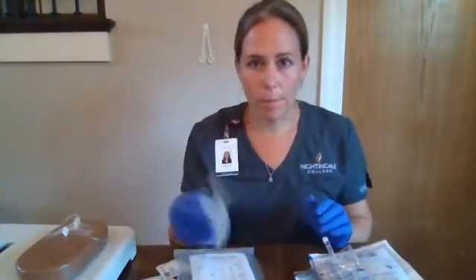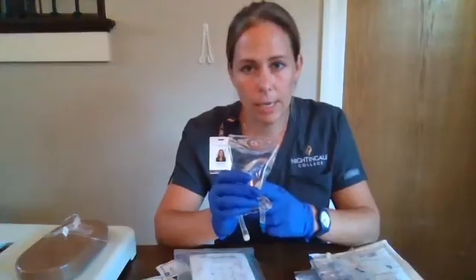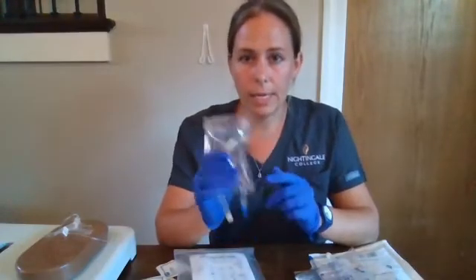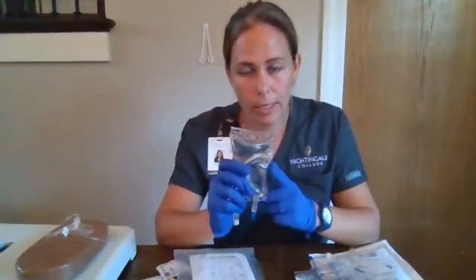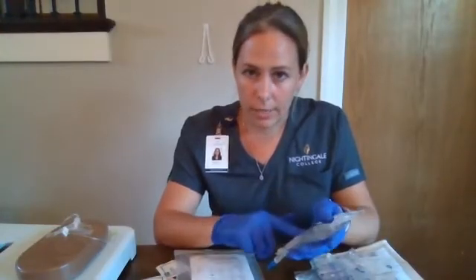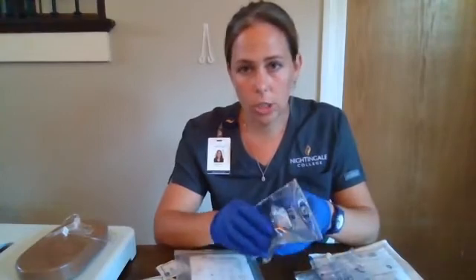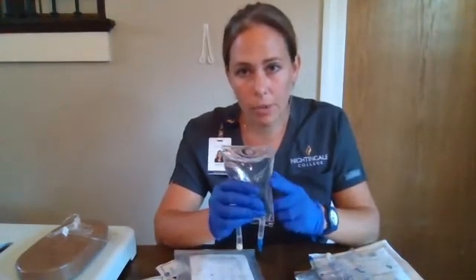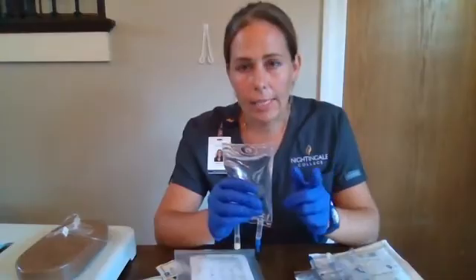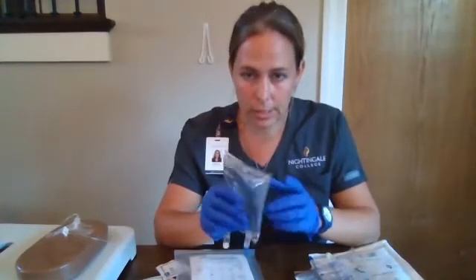We have our medication piggyback. Our doctor has prescribed 250 milligrams of amoxicillin to run over 15 minutes. This is supplied in a 100 milliliter piggyback. We have verified the six rights of this medication — the right patient, drug, dose, route, time, and documentation — as well as verbally confirmed with our patient and assessed in his chart that he does not have a known allergy to amoxicillin.